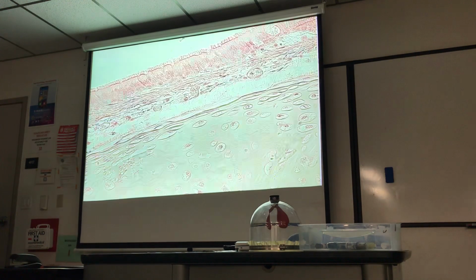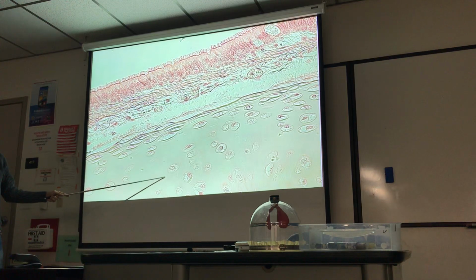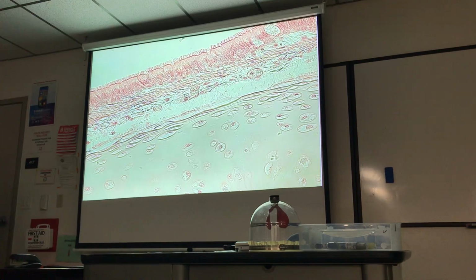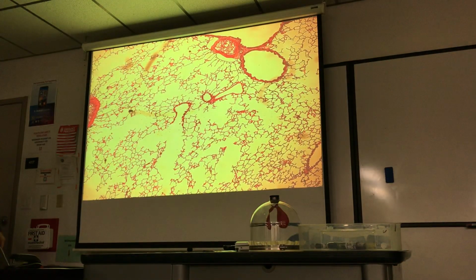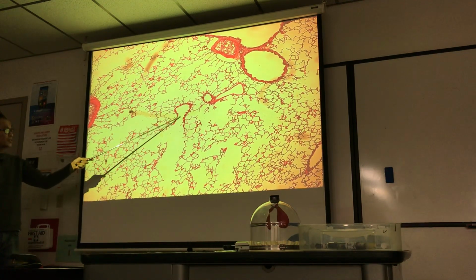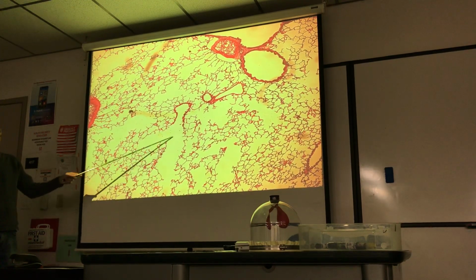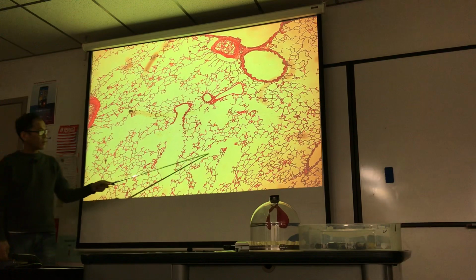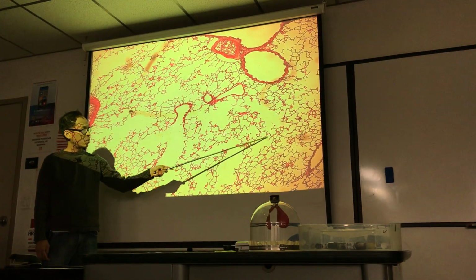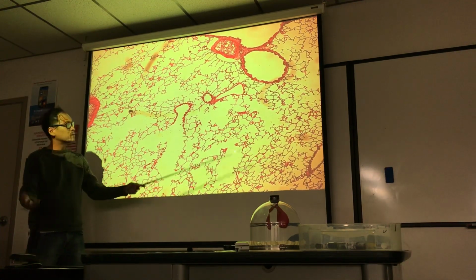This is a nice picture showing you the hyaline cartilage of the tracheal ring. What's the adventitial layer, but it's hyaline cartilage. That's the tissue type. If we go from trachea to bronchial lung tissue, that's a nice picture of a bronchiole right there. And do you see how it branches out into two, what would you call them? Alveolar duct, the hallway. Alveolar duct, alveolar duct. I think that's a good alveolar sac. And then what do you call the individual dead end spaces? The alveoli, or alveolus, if you will.